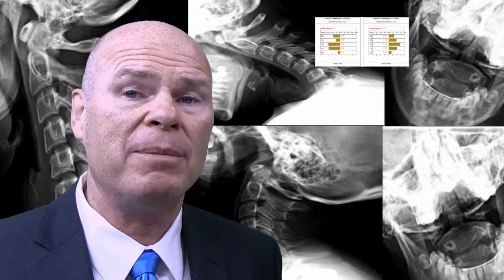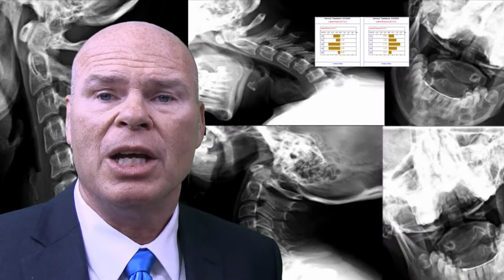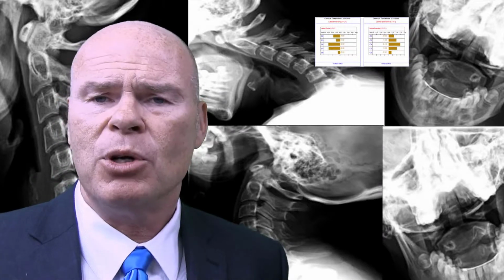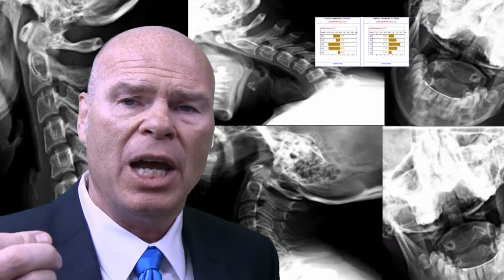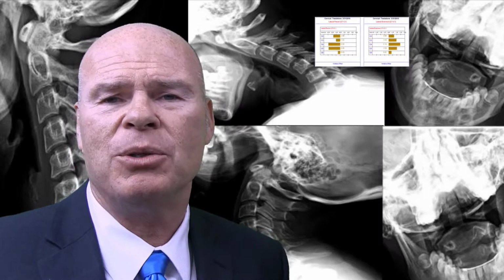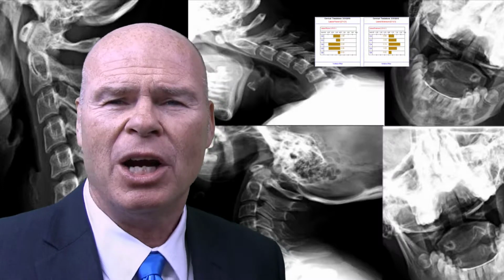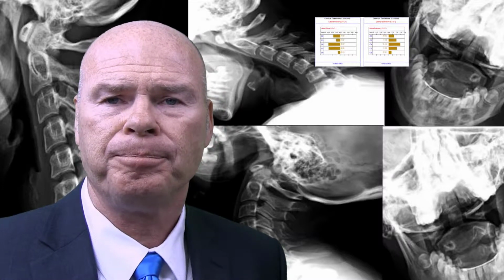So what that means is that you take x-rays, you have malposition or malalignment, and now you do a motor check at each level. Today, most doctors don't even know how to do that anymore. It used to be a standard procedure, and what's unfortunate is in most chiropractic colleges, most chiropractic students today do not know how to do an assessment for spinal injuries. Simple assessments for spinal ligament injuries are not being taught in chiropractic today, and it's very unfortunate.